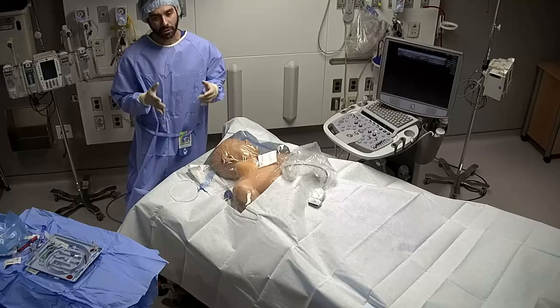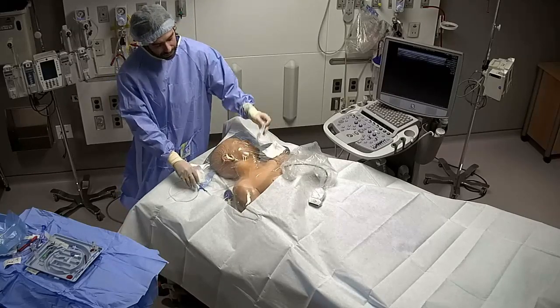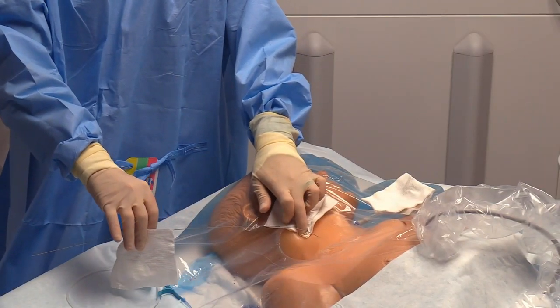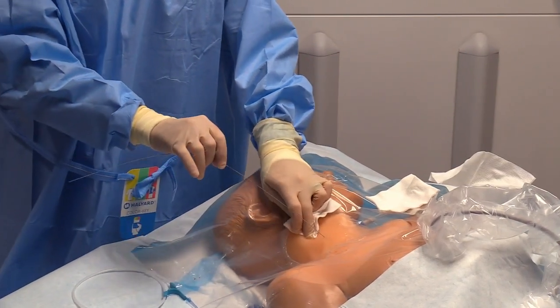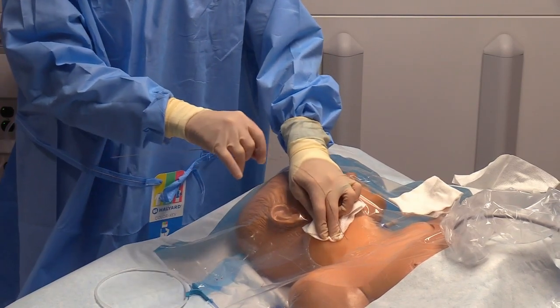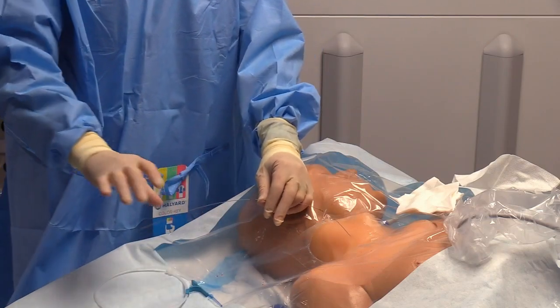Sometimes in obese patients, the skin will flop backwards, so you'll need to use a gauze tissue to pull and retract the skin to make it nice and tight as you nick the skin itself. So once you've done that, you've got the wire inside the patient. You've pulled back and recognized that. You can move your wire freely in the patient's neck, knowing that dilation will be very simple.